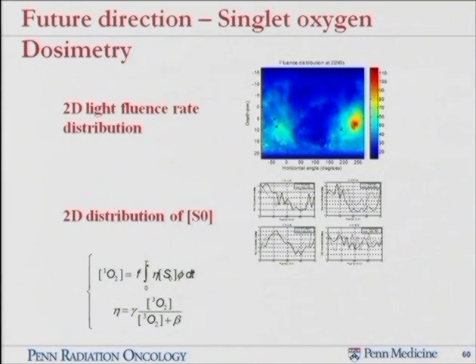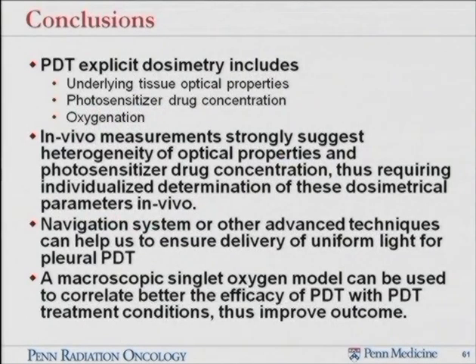The good thing is that this model, and also a lot of breakthroughs in the preclinical studies, will allow us to tie up all these quantities, oxygenation, light fluence, and drug concentration, together into a quantity which, hopefully, will correlate directly with the outcome, which is our hope, of course.